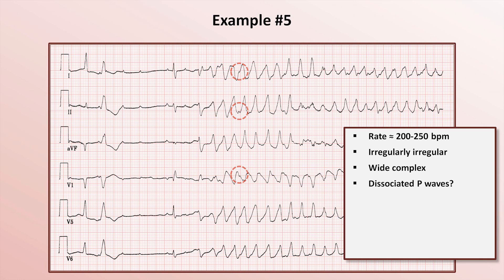We have an extremely fast, irregularly irregular, wide-complex tachycardia with possible dissociated P-waves. This is polymorphic VT.